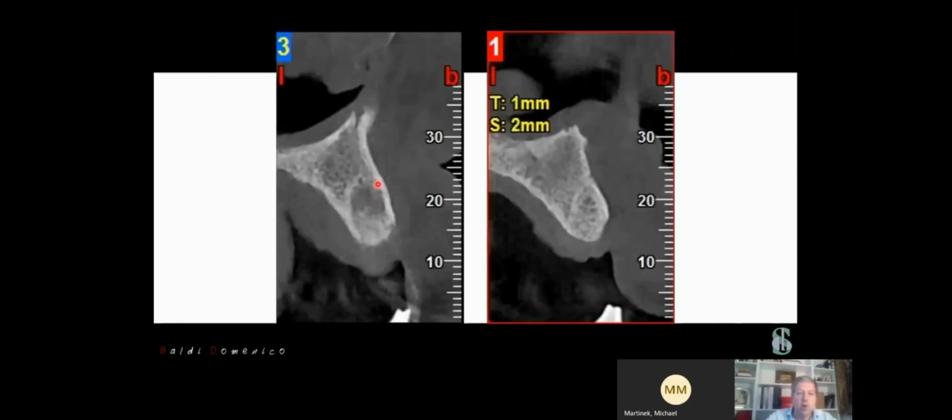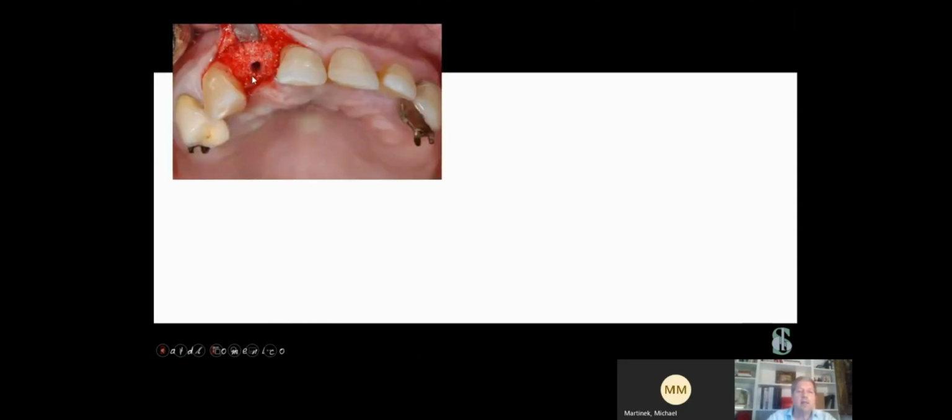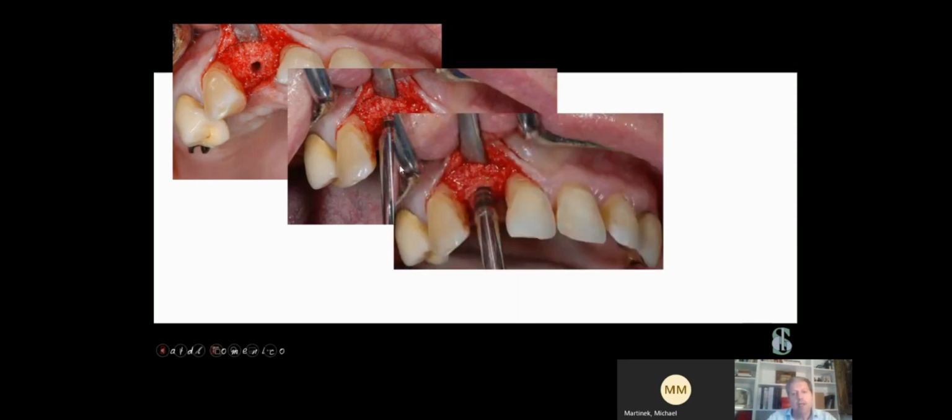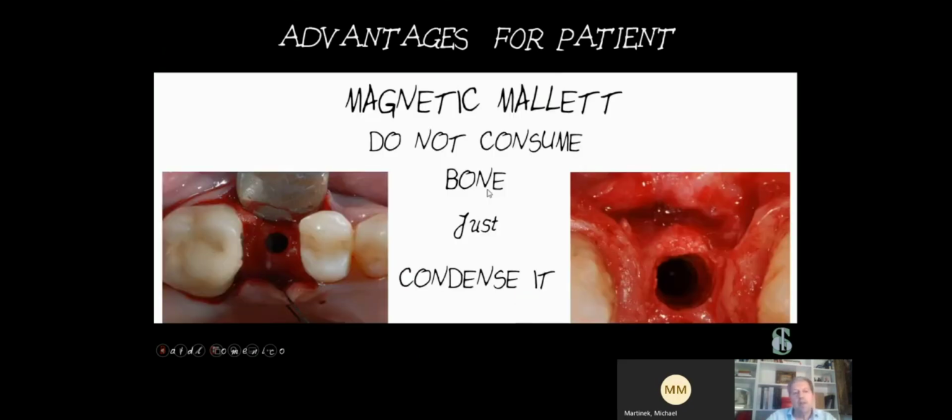But when we have this situation where we have a very thin cortical bone, in this situation we cannot be sure about the primary stability, because we also have a very, very bad sponge bone. We have to transform this situation into this situation. We have to transform this bone into a very hard bone. So we have to change the quality of the bone. With this magnetic mallet, it's possible to have a condensation of the bone in order to have a good primary stability, but at the same time a good response of the bone. So in a few words, we can say that the magnetic mallet doesn't consume the bone, but just condenses it.